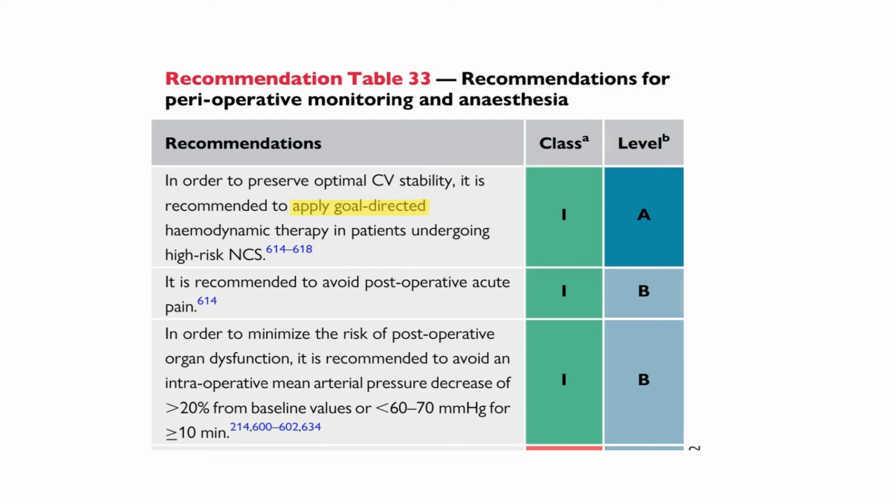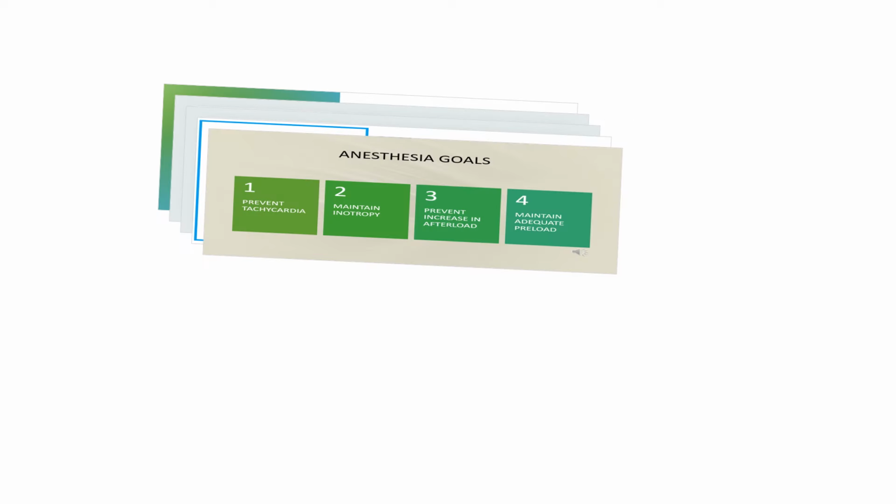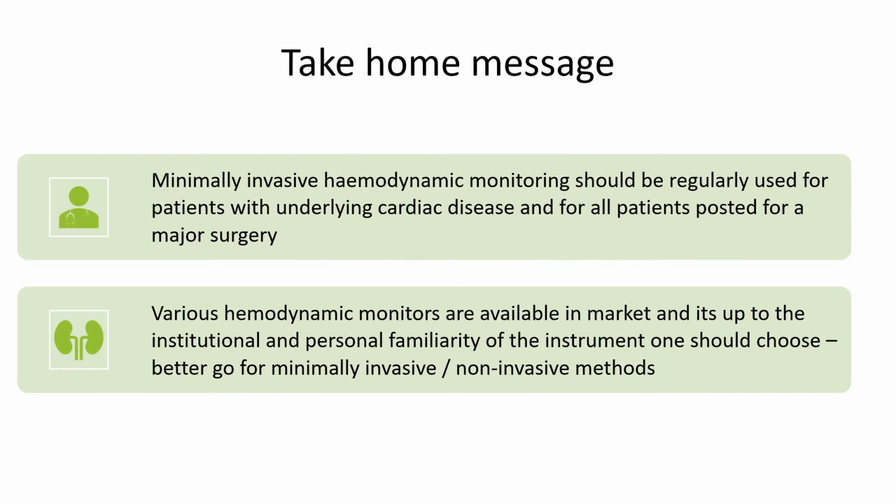Whether to use or not to use, it is a class 1 recommendation to apply goal directed hemodynamic therapy in such cases. It's a class 1A recommendation. So it's my advice that if you have these monitors, please use them in such cases. A take home message: minimally invasive hemodynamic monitors should be regularly used for patients with underlying cardiac diseases, and for all patients, irrespective of their cardiac status, for major surgeries.